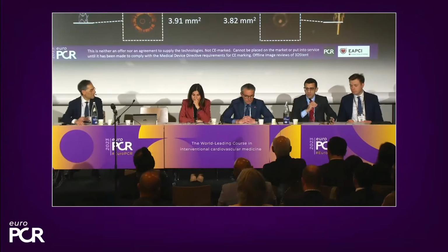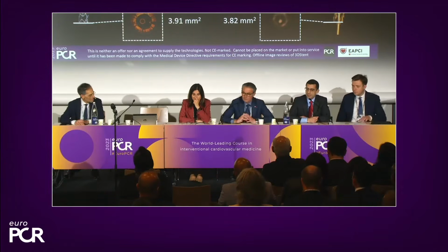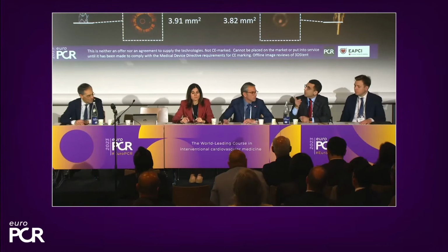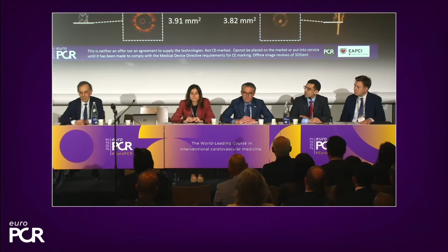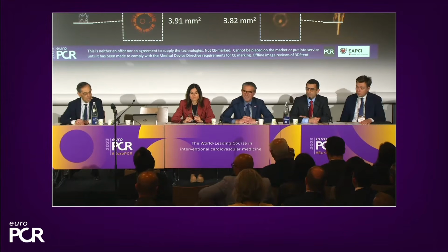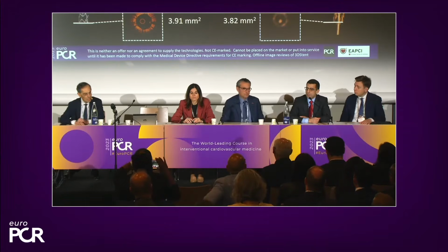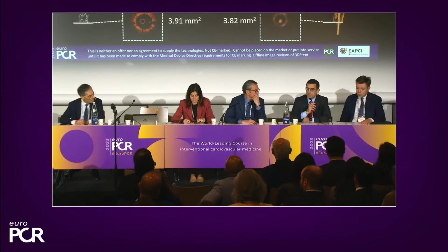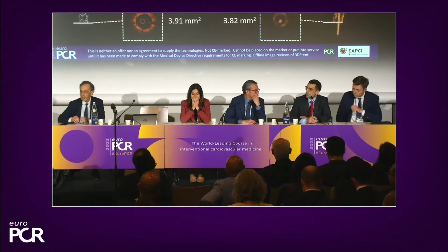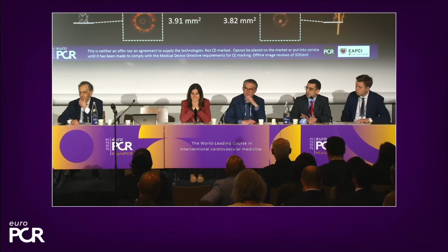So thanks, Carlos. Personally, I have to say that when I saw this image that now is there on the big screen, I was impressed by the fact that we can get almost the same measurement between OCT and 3DStent. So that is something that is impacting me very, very much. I saw in your presentation you talk about BMI that maybe is a limitation, so we may have some suboptimal results. So maybe I will ask you to comment a little bit more about what you mean with these suboptimal findings.